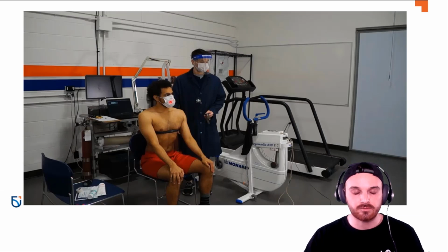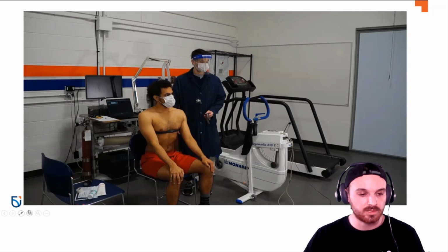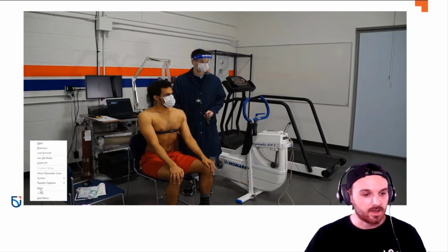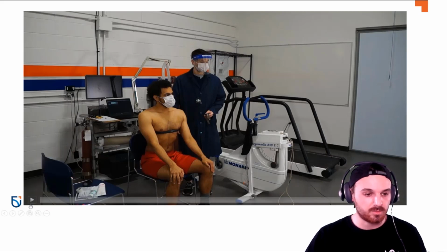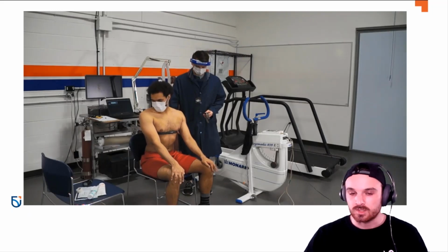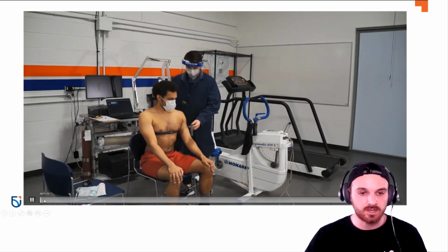I'm going to duck off here for a second and I'll commentate over this a little bit, but I'm just going to play this video of us running the test, and I'll talk over it just a little bit here. I think I can get out of my pointer there. Okay, so I'll let that play. Actually, I'll stay on just for the setup here.